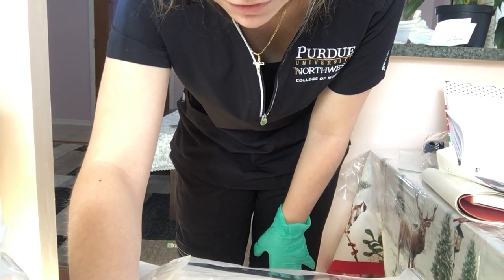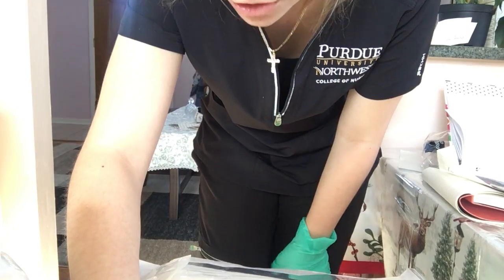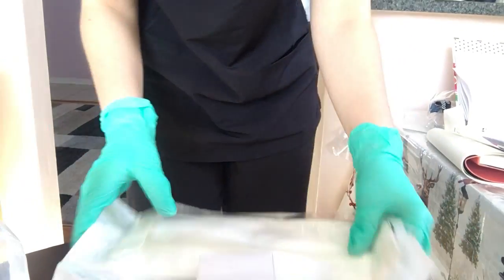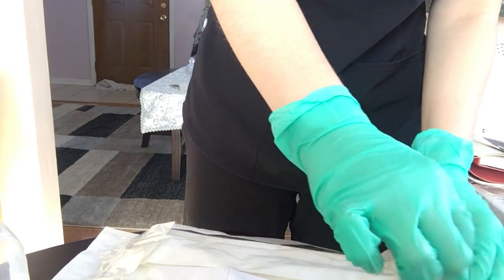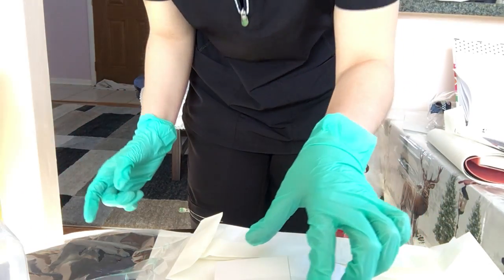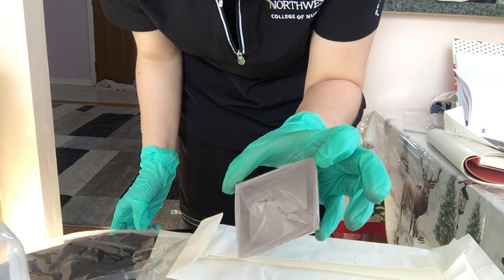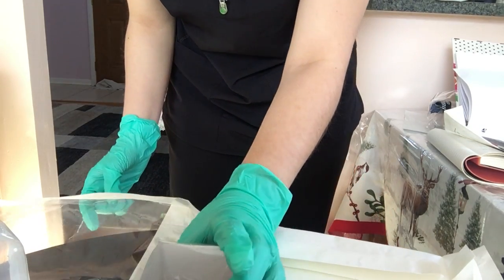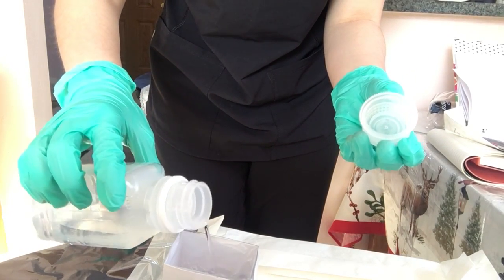Okay, so after that, we would then open our sterile suction package using aseptic technique. So here is our sterile suction package. I already have my sterile gloves on, and we would open it from one side, this from one corner, and the open part of the container can be used as sterile as well. So then we would carefully remove the sterile container, touching only the outside surface, and set it up on the work surface and pour our sterile saline into it. Pour the sterile saline into here.